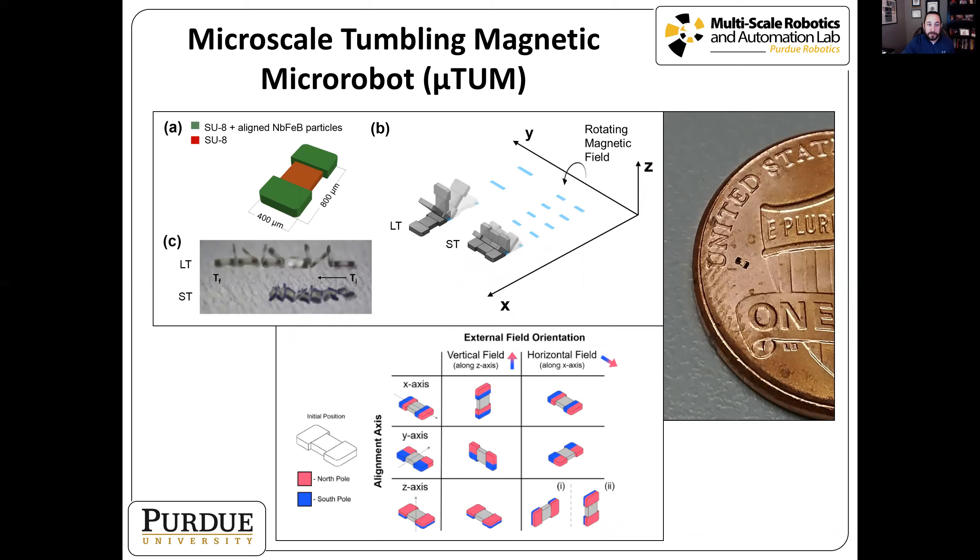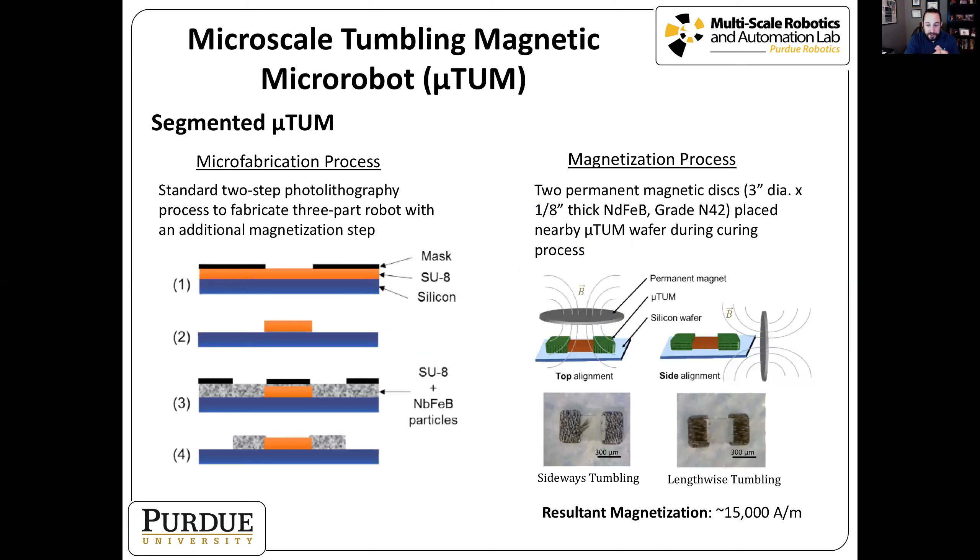This robot is about 400 microns wide and 800 microns long. During fabrication we can embed and align magnetic properties different ways, so the robot responds to either a rotating magnetic field for lengthwise tumbling or sideways tumbling. We have a segmented version with two magnetic bodies at either end and a non-magnetic section in the middle, made using a standard two-step photolithography process. During curing, we place a magnet next to the wafer — on top for sideways tumbling, or to the side for lengthwise tumbling — to align the magnetic particles.